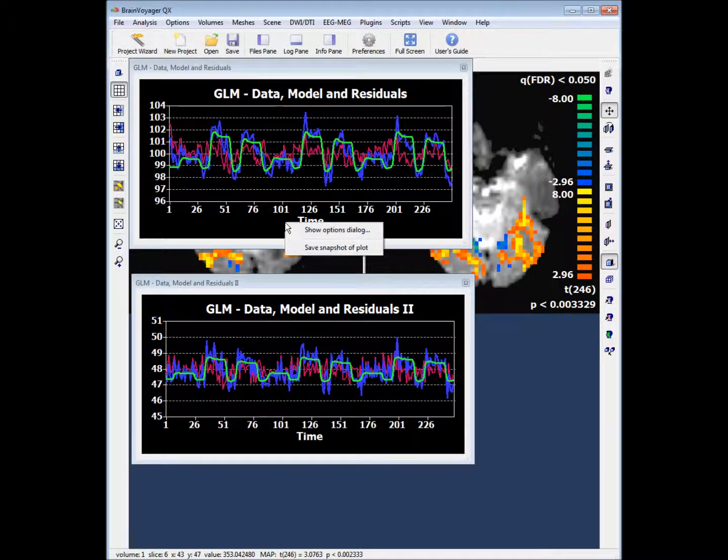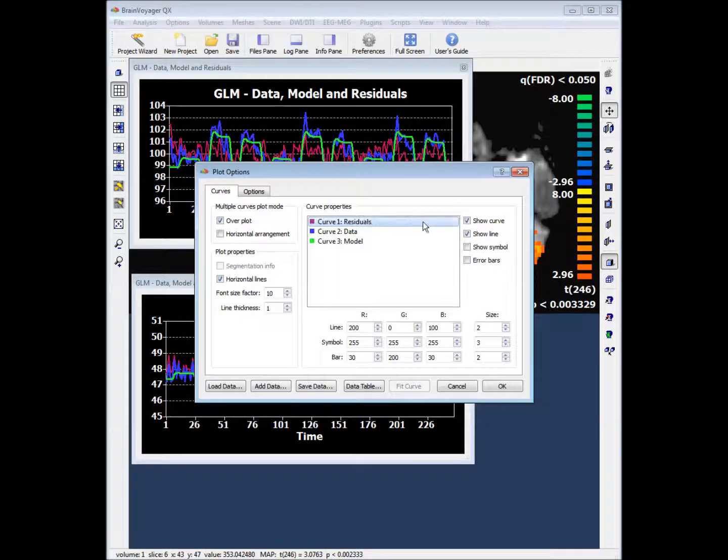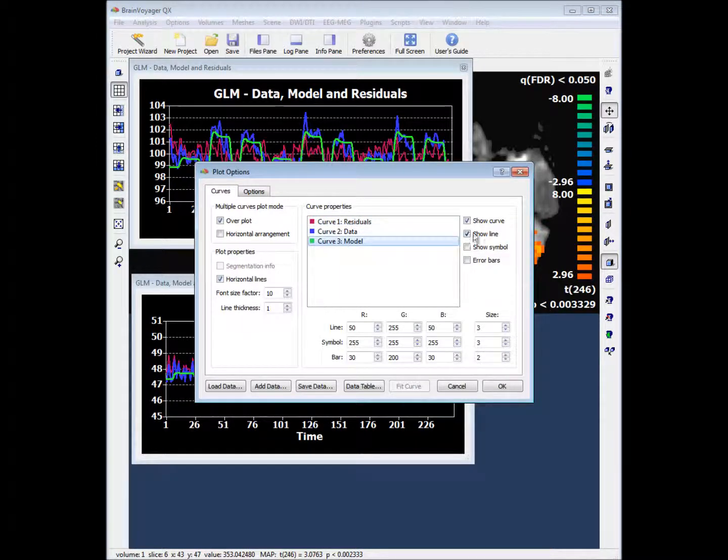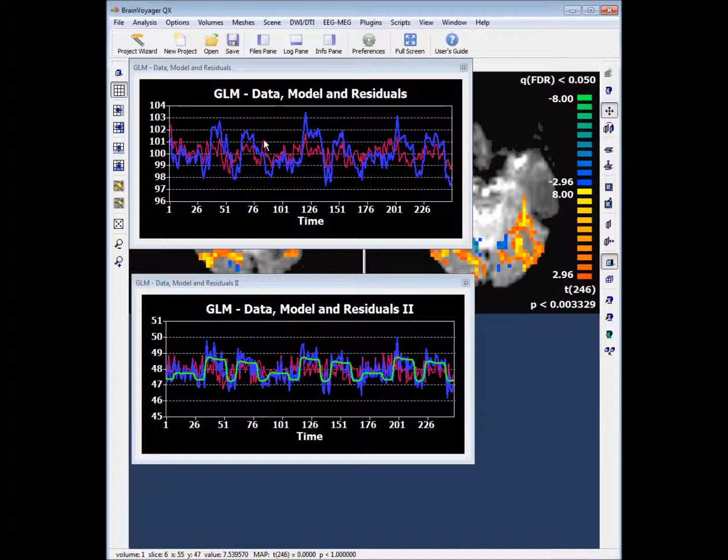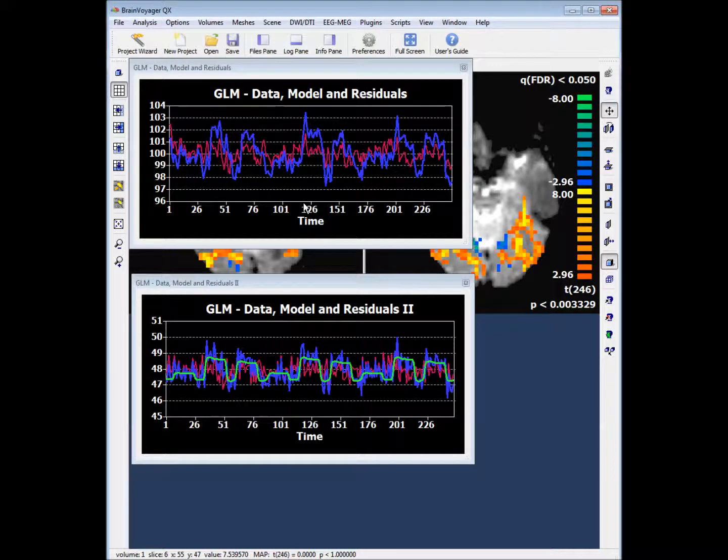If you want to save any of these plots you can right click on the plot. In the show options dialog window you can change which curves are plotted on the graphs. This ends the tutorial on GLM analysis.